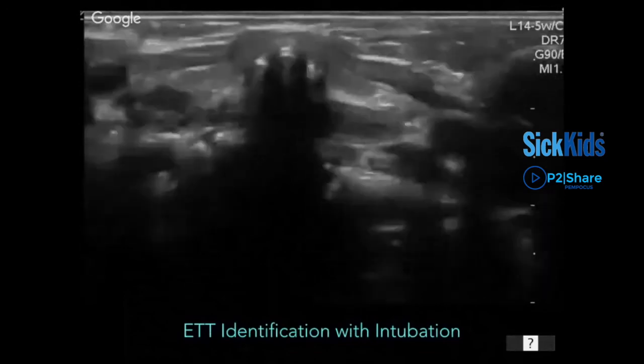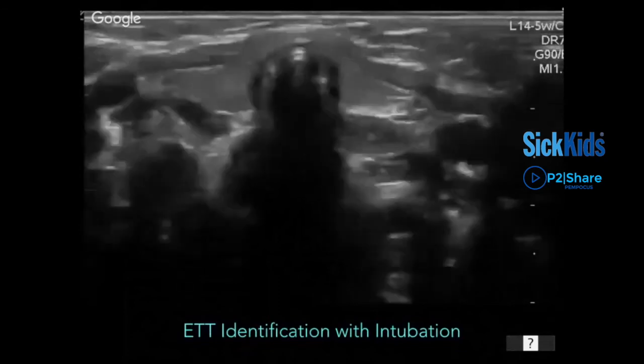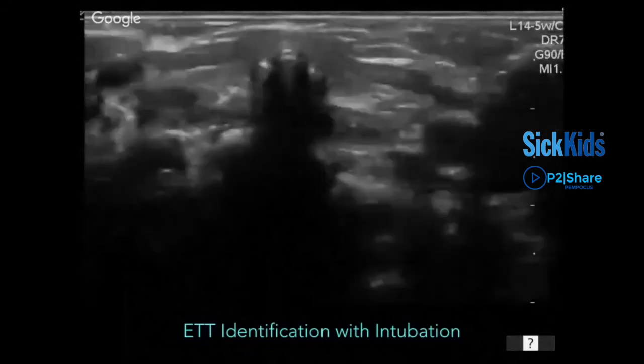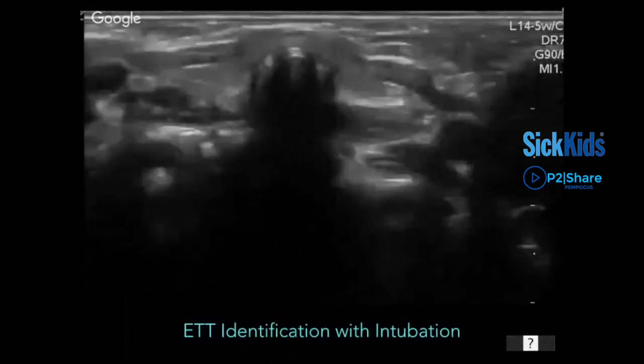So this is a better way to confirm airway, that your ET tube is in the right place. Sorry, the comet tail is just the ping-ponging? Sorry, the second sign is what in addition? So it's in longitudinal. Oh, okay. So yeah, we don't have a picture of that. It's in the textbook.